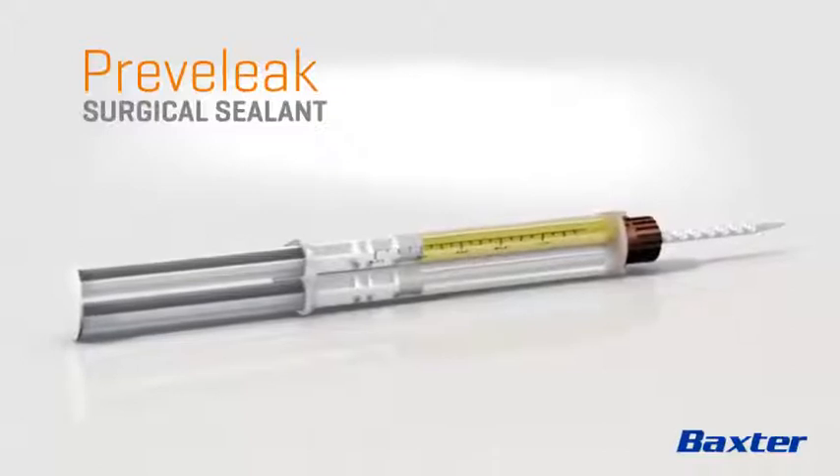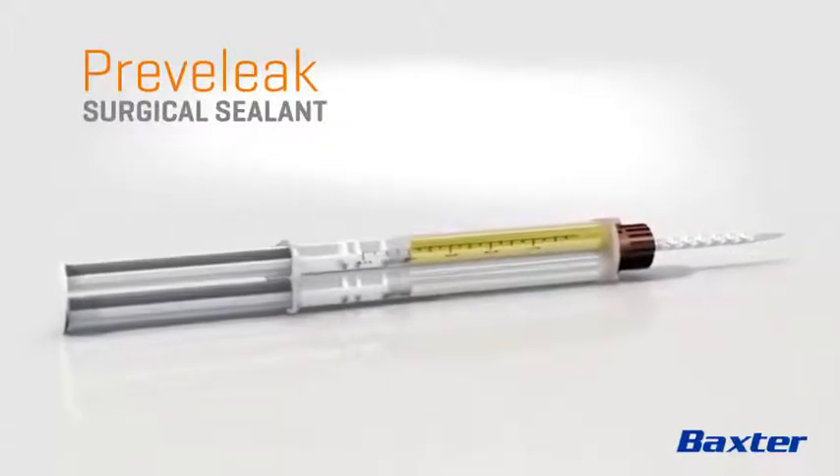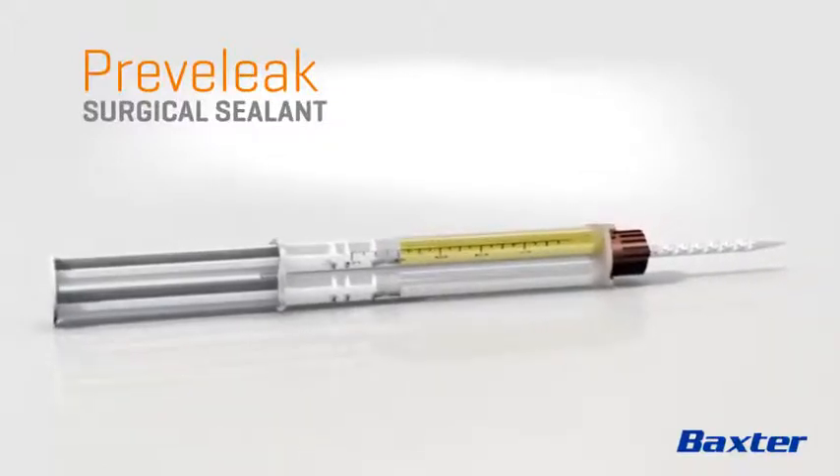Previleak provides the proven performance you need to confidently seal high pressure suture lines.